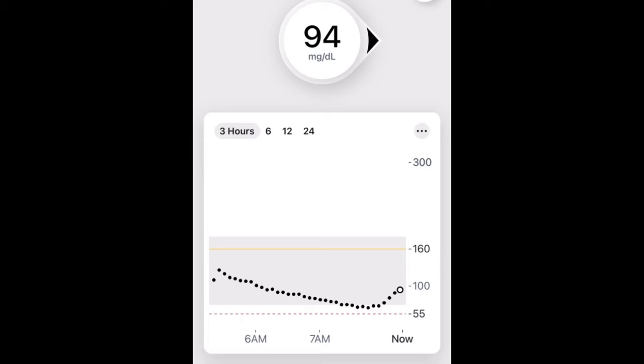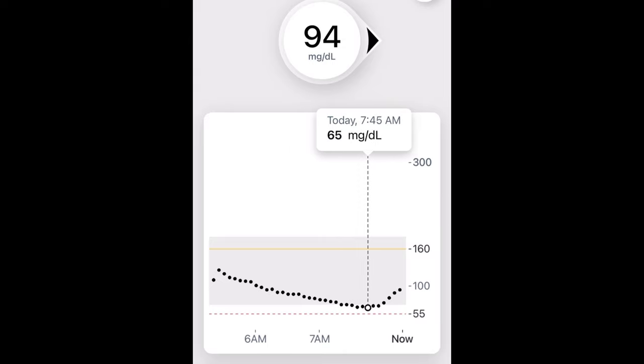Another thing I really appreciated — this is something minor, but on the main screen you can actually touch your glucose data and see each individual reading. This is something you could do on the G6, but you had to turn it into landscape mode to access it. Now it's readily accessible right from the main screen — you can access all of the individual glucose readings throughout the day on that home screen.